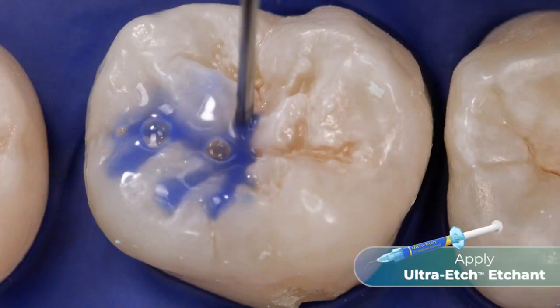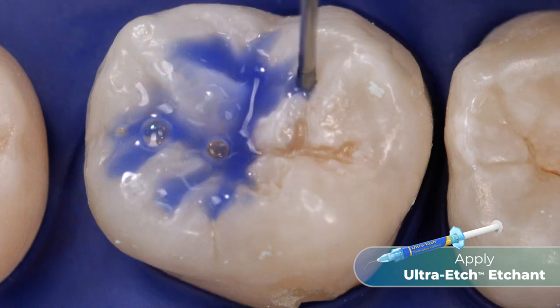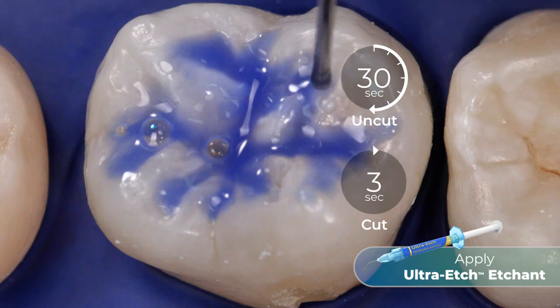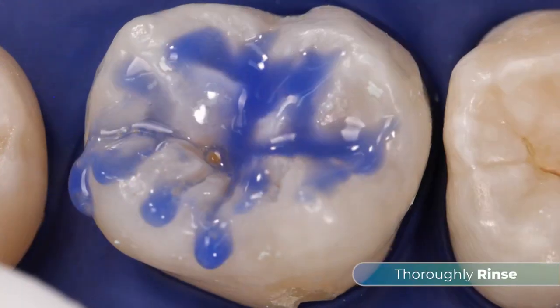Once the tooth surface is prepared, apply Ultra-Etch Etchant, a 35% phosphoric acid etchant, to the fissures for 30 seconds on uncut enamel or for 15 seconds on cut enamel. Thoroughly rinse the tooth.